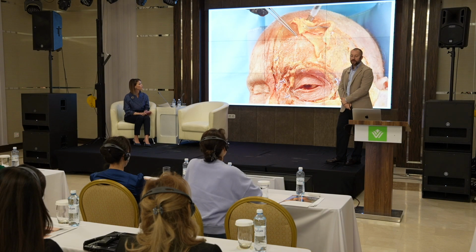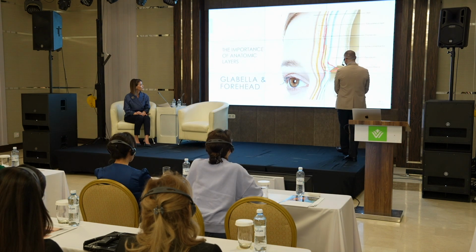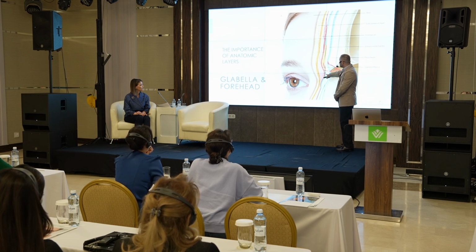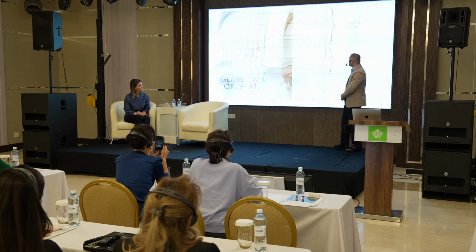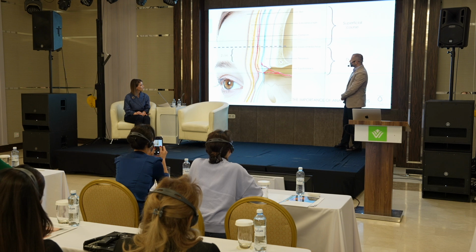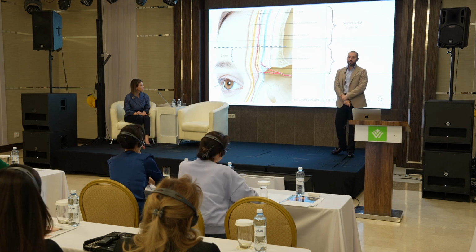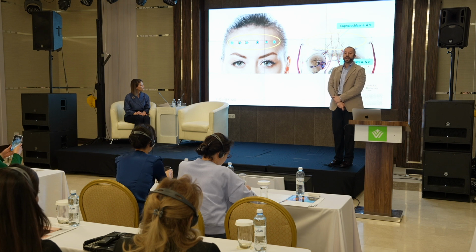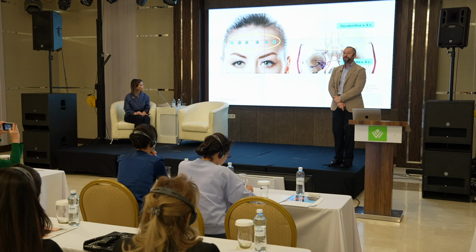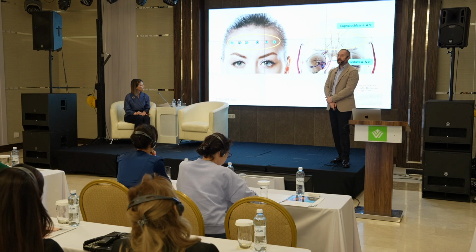So fat tissue, and I want to show the injection deep to the muscle. Let me remind you again: skin, fat tissue, the yellow one, then the muscle, and underneath the muscle are the fat and the galea. You see, these arteries come deep to the bone, approximately 2 centimeters, then pass through the tissues and the muscle, and come more superficially. A deep course and a superficial course. And I told you, you can also inject this area with a needle deep to the muscle, deep to the galea. This is also one technique you can use to inject the forehead area.